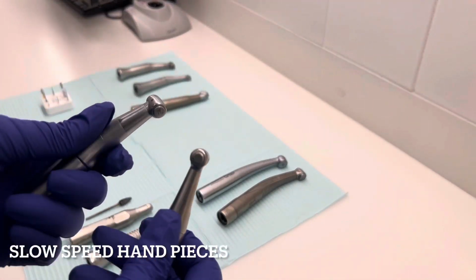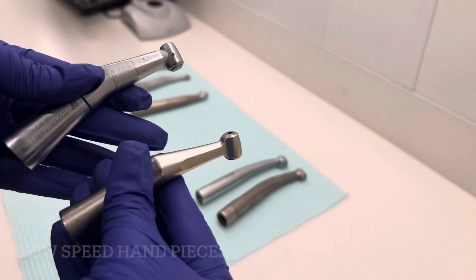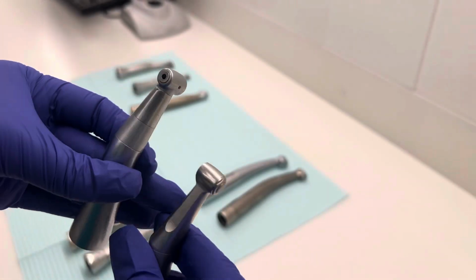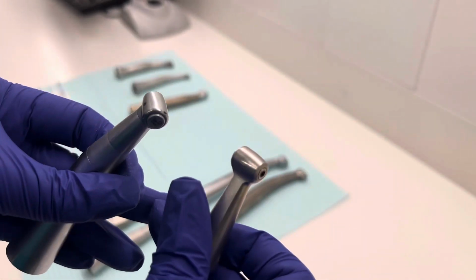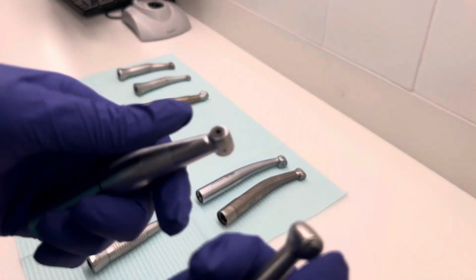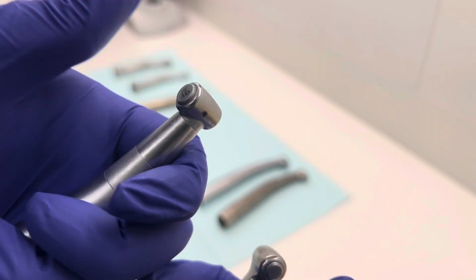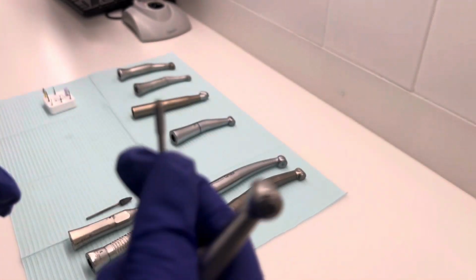Okay, now we're going to move on to the slow or low speed handpiece, usually called interchangeably. Could be called a low or a slow speed handpiece. And these are usually identified as being much shorter than the high speed. So that's the easiest way to tell the difference. Otherwise, they pretty much almost look the same.